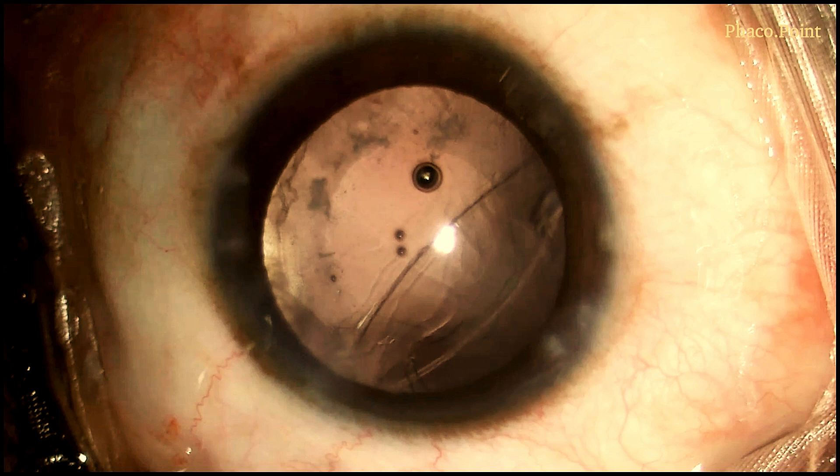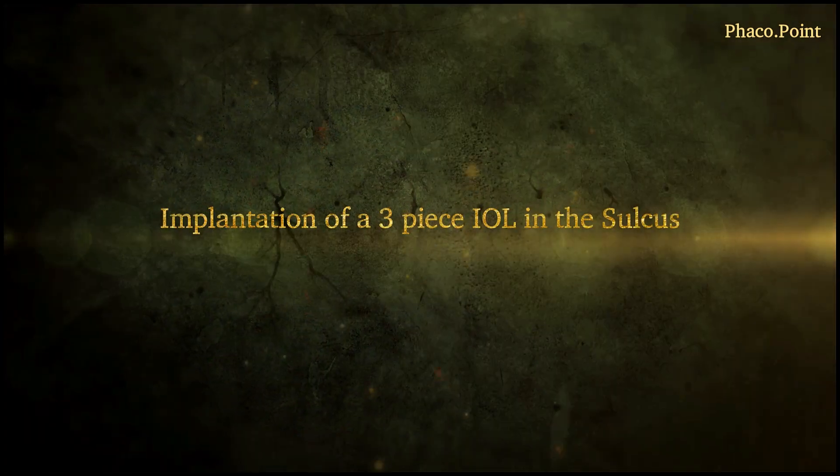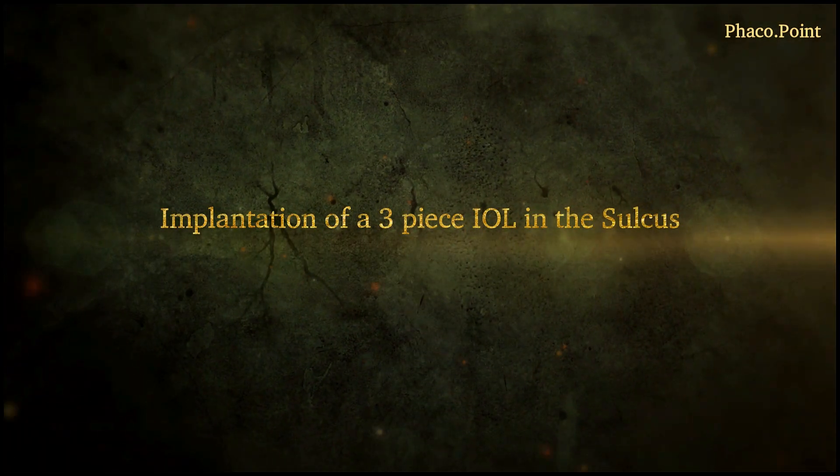You will notice that the tear in the posterior capsule has regained its normal shape. With the anterior chamber now free of vitreous, let's move to the implantation of the 3-piece IOL in the ciliary sulcus.